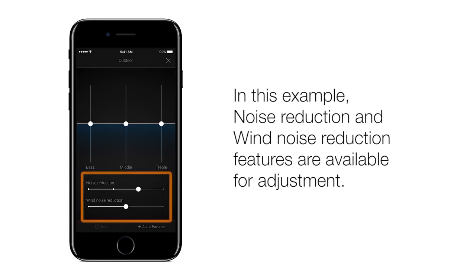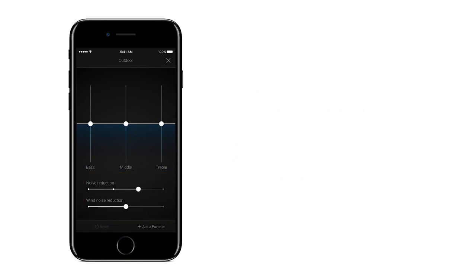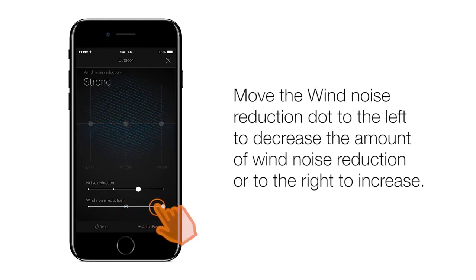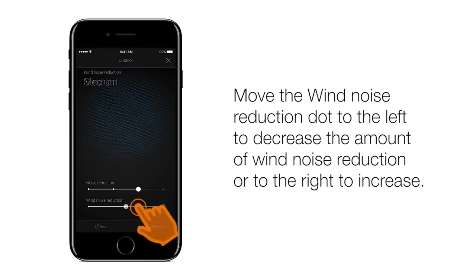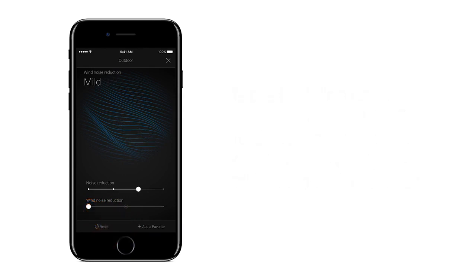A box appears around the sliding scales at the bottom labeled Noise Reduction and Wind Noise Reduction. Move the wind noise reduction dot to the left to decrease the amount of wind noise reduction, or to the right to increase. Slides the wind noise reduction dot to the right to strong, then back left one notch to medium, then all the way to the left to mild.